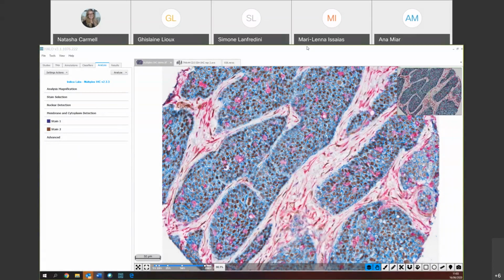As Natasha mentioned, I will run through multiplex IHC, ISH IHC and the FISH IF module today. I will pause between parts for you to ask questions. And if you have any question during the training, please feel free to interrupt. Or is there any comments someone would like to make before I start? All right, so I will be starting then.